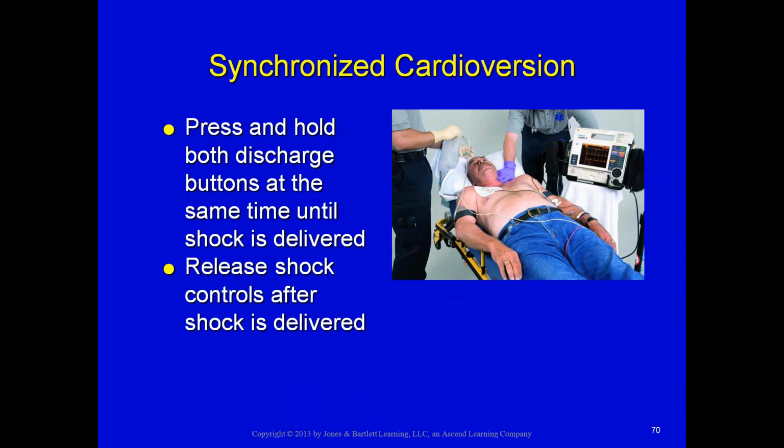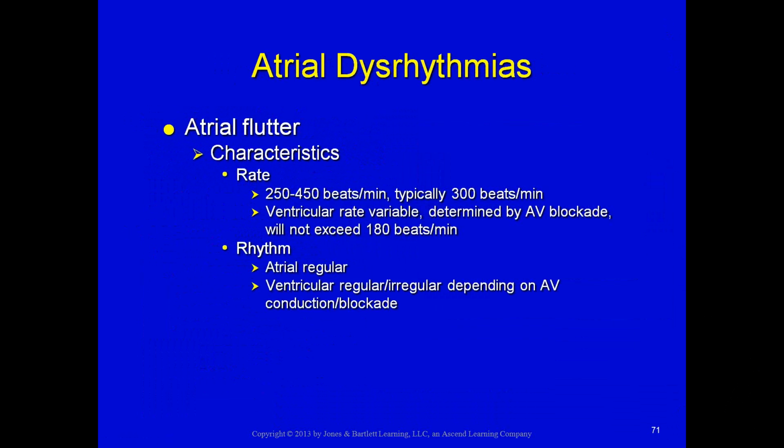They may shout out if they're not completely sedated because it hurts, and you'll need to reassess. If they're still in that rhythm, just push the sync again, go up to whatever the next energy level is, and keep repeating that process until they're out of that fast heart rate.